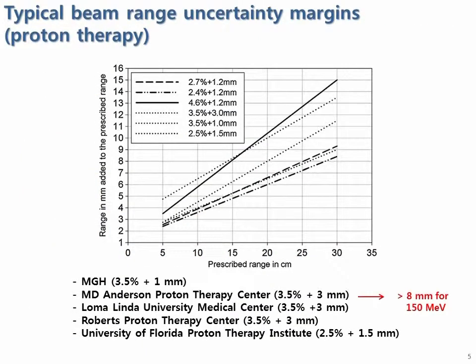Due to the uncertainties in the particle beam range, the treatment margin is usually employed in particle therapy. Because this margin delivers unnecessary dose to normal tissues, the technique for real-time verification of the beam range in patient should be developed to fully utilize the advantages of particle therapy.